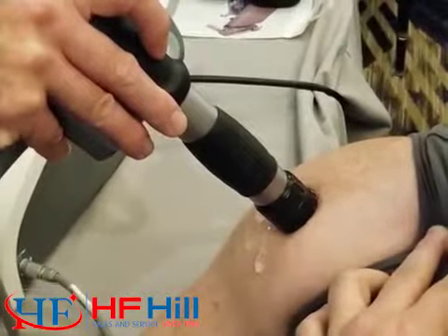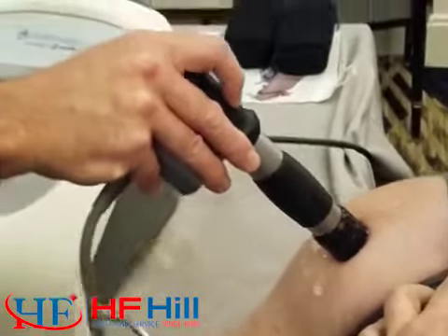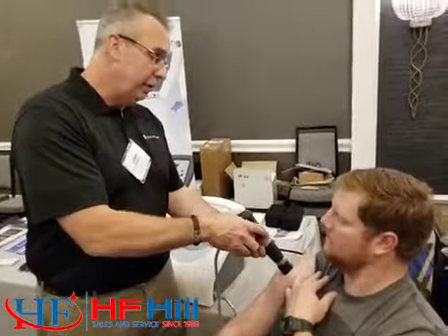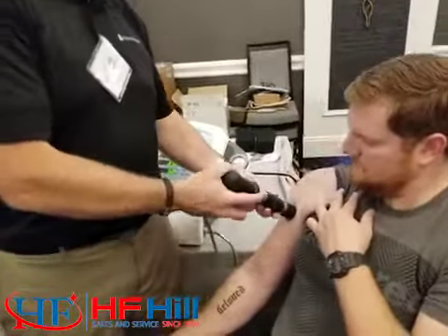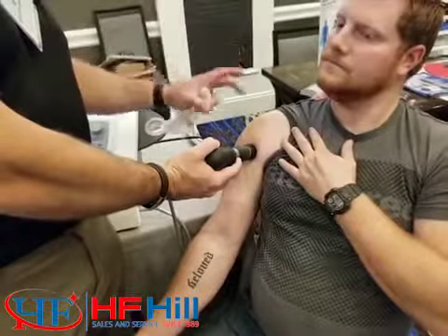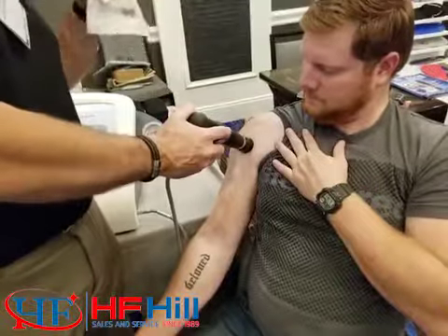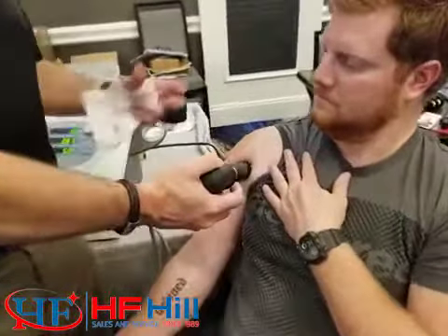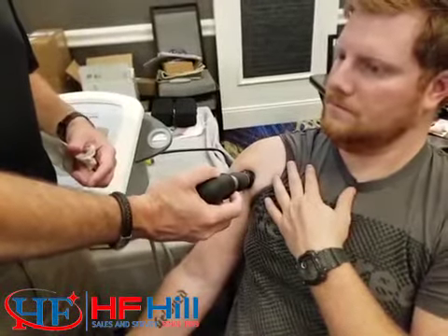So we're just over 300. We're going to look for a total amount of impulses at this given time, especially when I'm treating a patient for the first time, around 500 at each point. So we can say that we hit 500 there. Now we can move to a different position if I actually wanted to work the muscle in a different area. But remember that the pathology is in a very specific area, and that should be the goal. This is designed to create tissue insult to the area, and it is not a massager. It generates a lot of energy over a very, very short period of contact time. So I go to my second point, and again, I'm going to impart somewhere between 500 and 1,000 impulses.